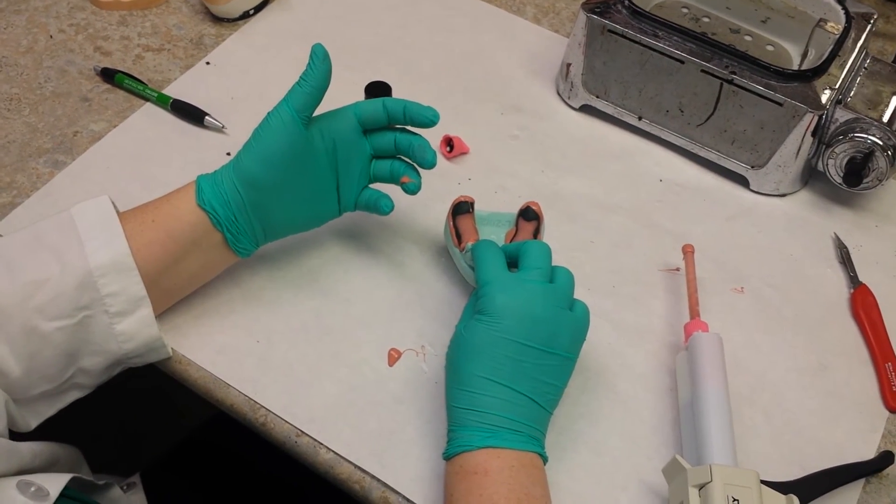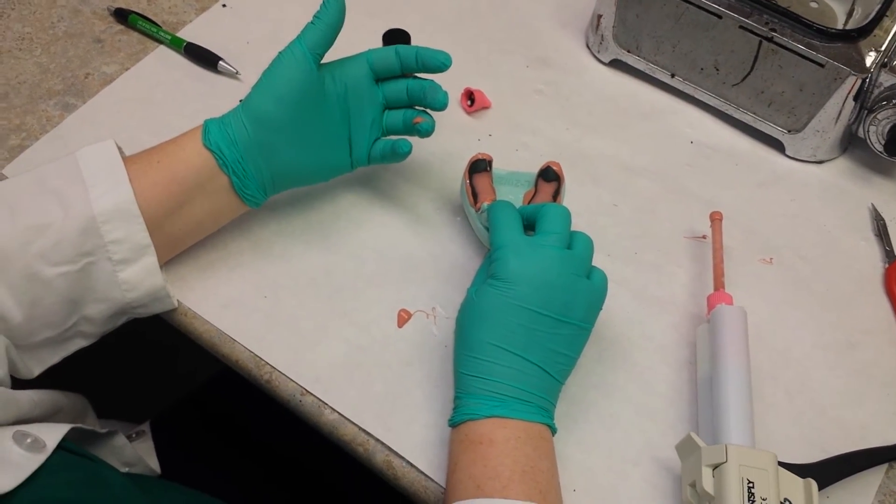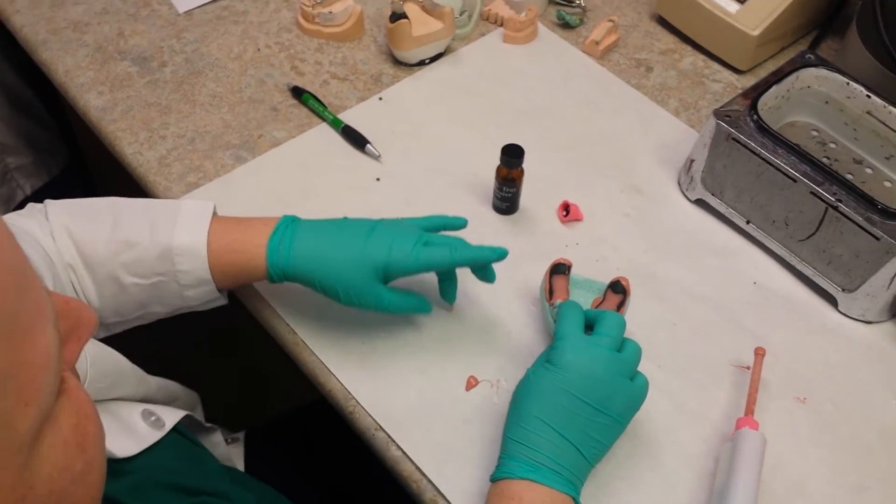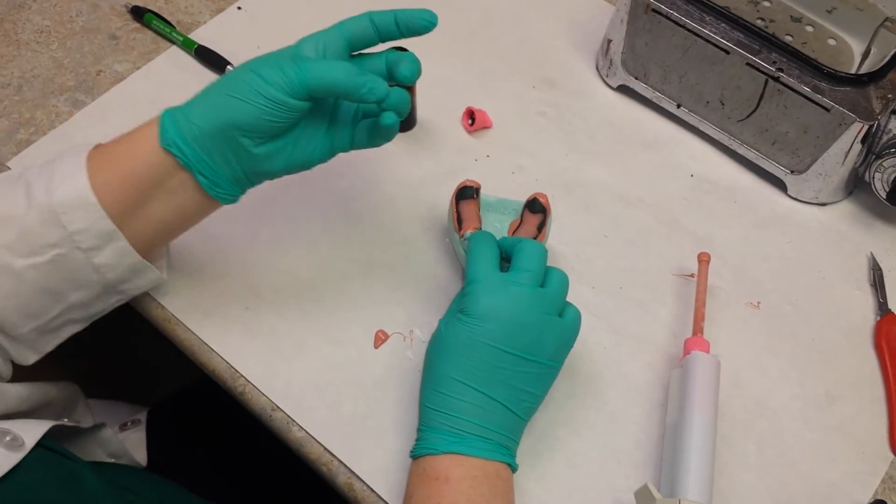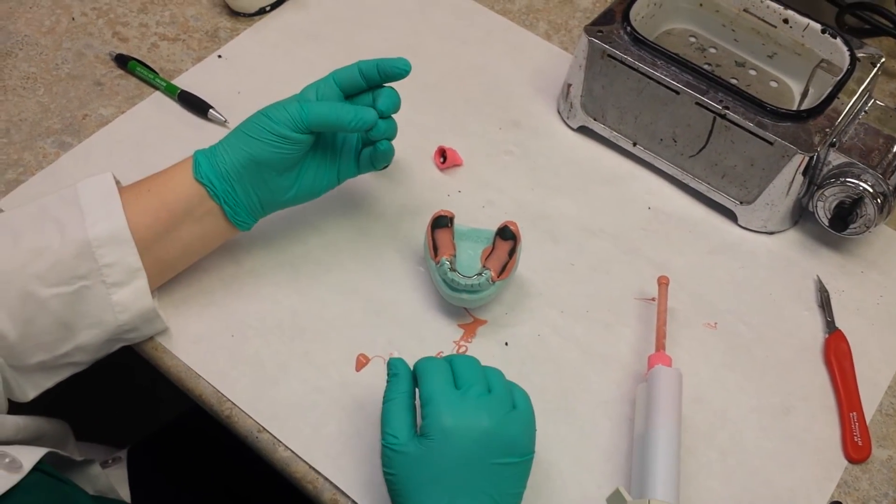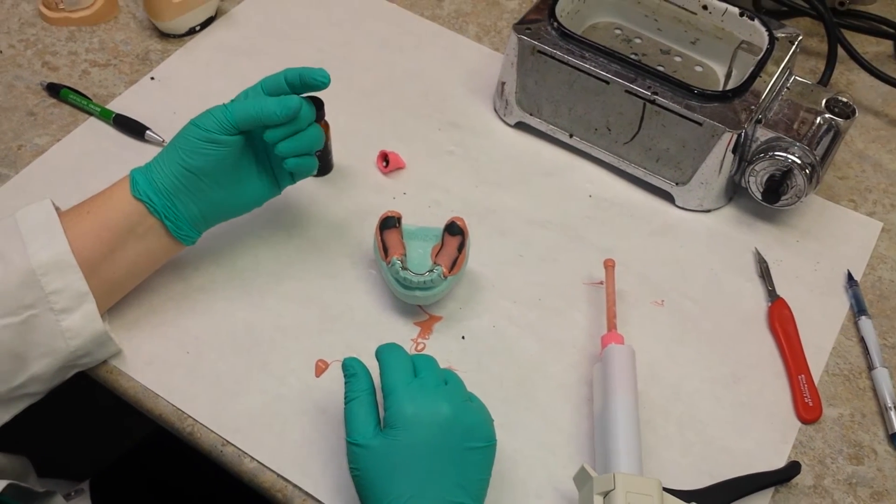You can see when we used to use the rubber base material, the frustrating part about that is you'd have to hold it for 10 minutes in position. The nice thing about it is you would never get this mess because the material had a really nice viscosity. So it depends on what you're used to and what you like.